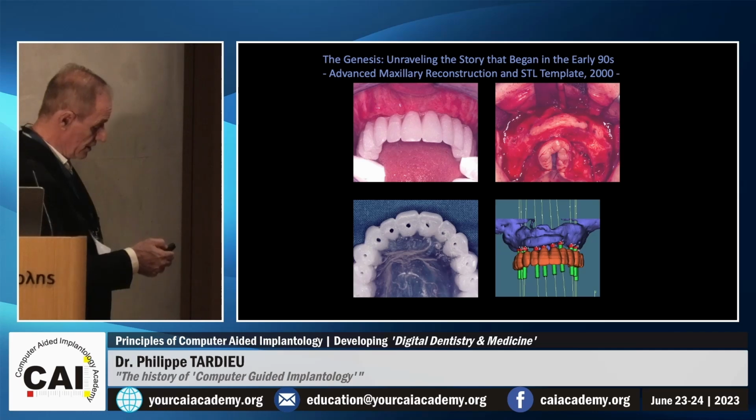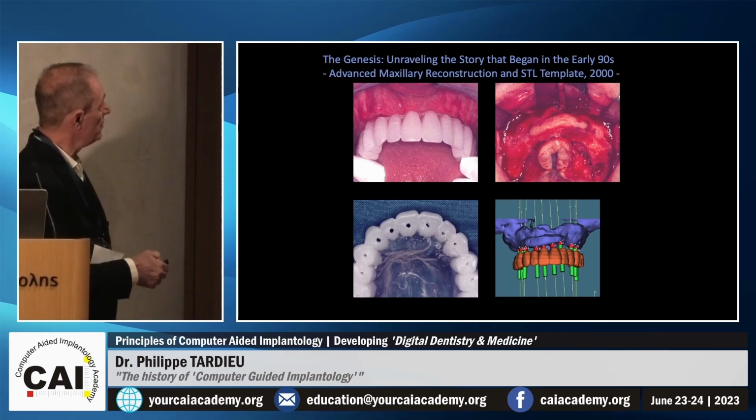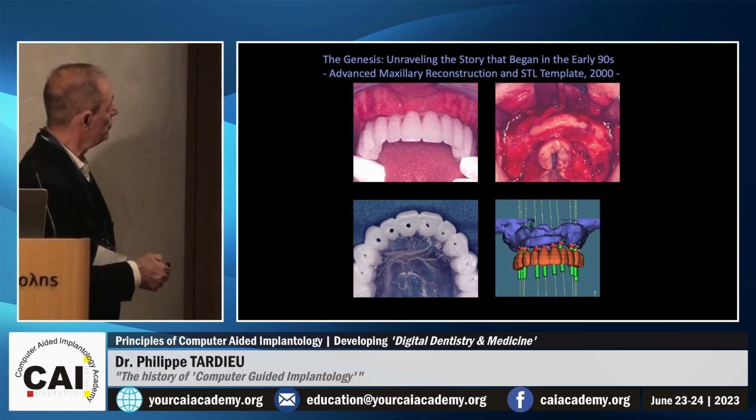And what's interesting is that we've been planning this with the kind of surgical scanner guide that I've been showing to you. And this is what we want. This is what we plan.